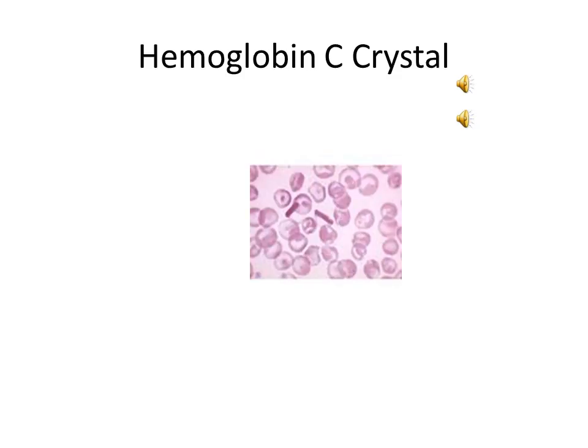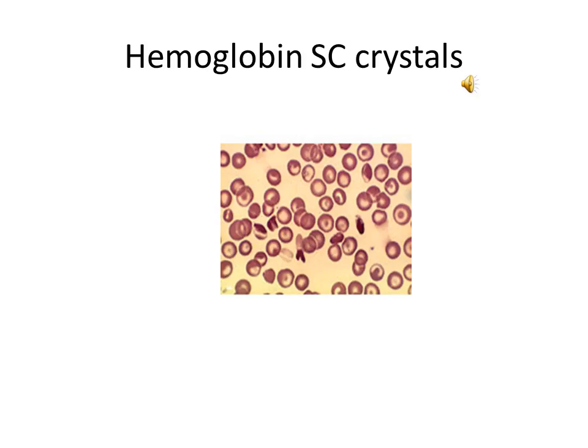In this slide, you will see the hexagonal-shaped crystal inclusions. This is from a patient with hemoglobin C disease. They may not always be demonstrating hemoglobin C disease, but their appearance has been found to increase after splenectomy. Hemoglobin C crystals are not seen in hemoglobin C trait. Hemoglobin C crystals are said to resemble a bar of gold. SC crystals are seen in hemoglobin SC. The projections have been said to resemble the Washington Monument. Therefore, SC crystals may be referred to as Washington Monument crystals.